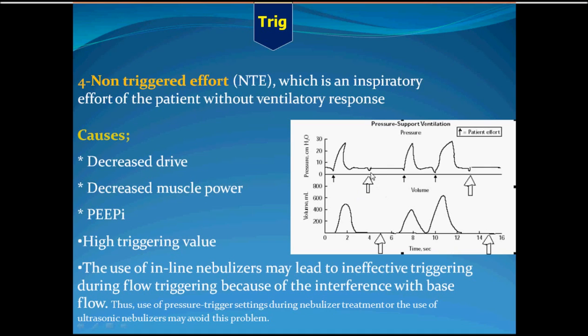Well, the patient can develop 1 or 2 centimeters of water, and for sure this will not open the demand valve, because the demand valve has been set to a certain value, and the patient didn't reach this setting. What are the causes? You have to look for the causes.